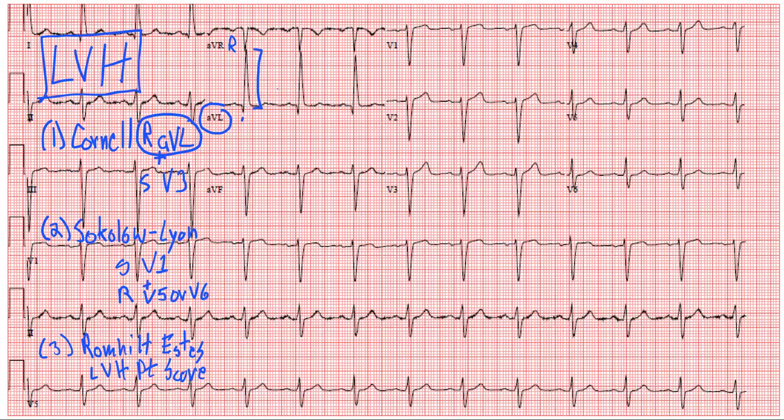So it'd be from here to here, and we have about 1 big box, 2 big box, 3 big box, then probably about 4 small squares, and then at the top 1 small square. So we'll say that's another big box, so it's 4 big boxes. Each big box is composed of 5 small boxes, so that's going to be 20 small boxes, or 20 millimeters, because every small box is a millimeter.